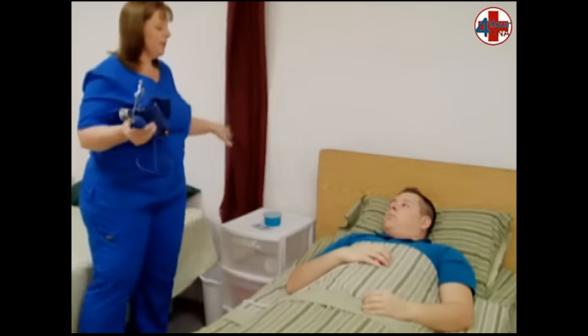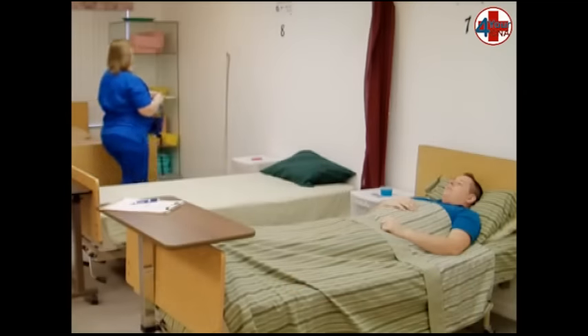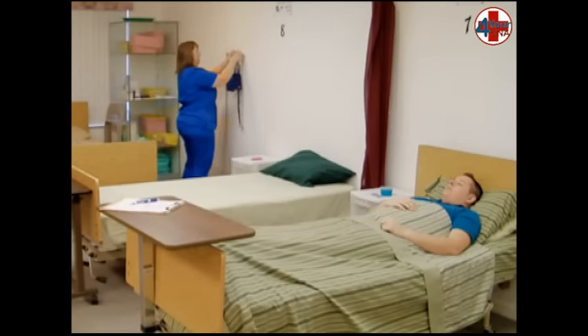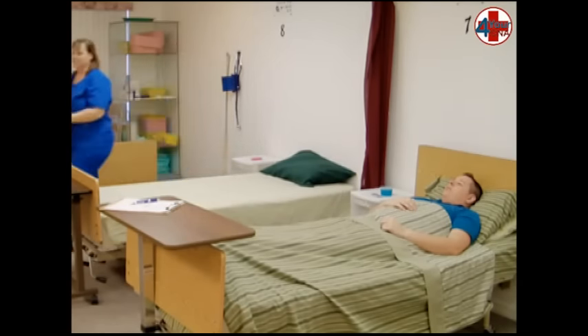Open the privacy curtain, making sure your patient has his call light, and return your equipment to its storage area. Wash your hands.